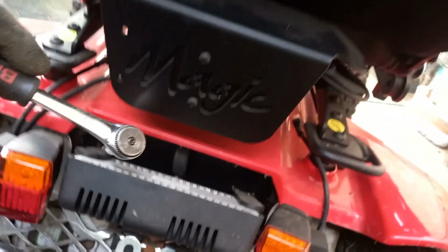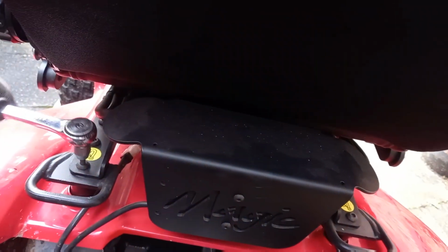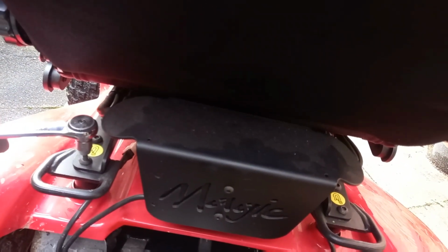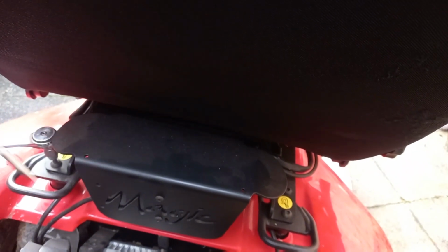But we don't need to touch that, because we're going to be leaving everything attached to the seat, disconnecting the seat on its main fasteners here. There's two at the front and two at the back. The back ones are easy to get to. The front ones are hidden slightly behind a metal cross member, and luckily I've got an Allen key. That's a standard length of Allen key. Well, that won't go in. It's too high to manage to go in, and you can't get a ratchet in. You can't get anything in like that with a bit or anything like that.